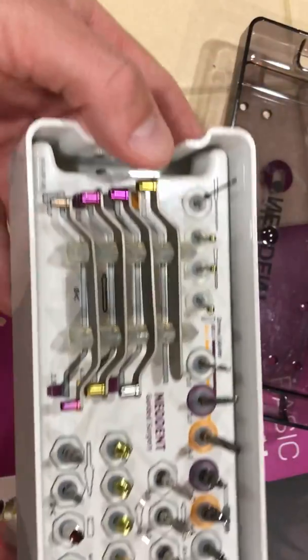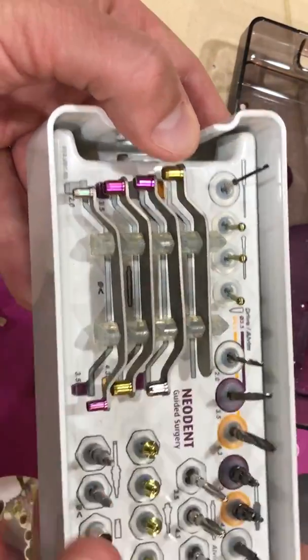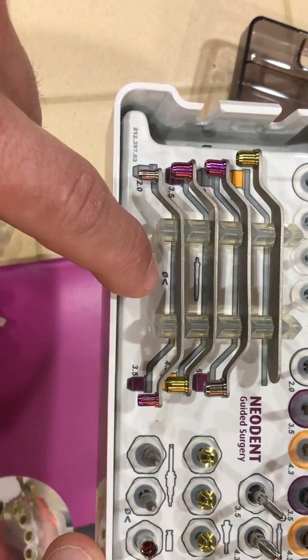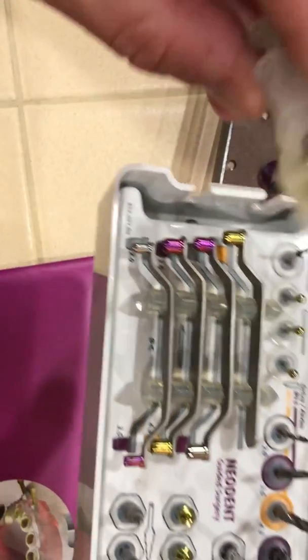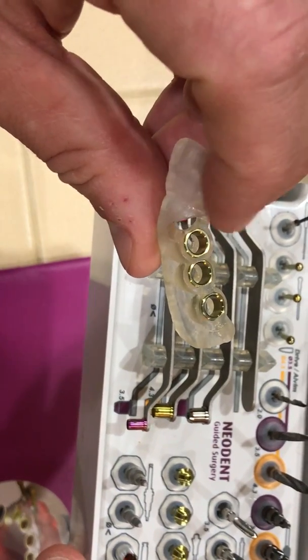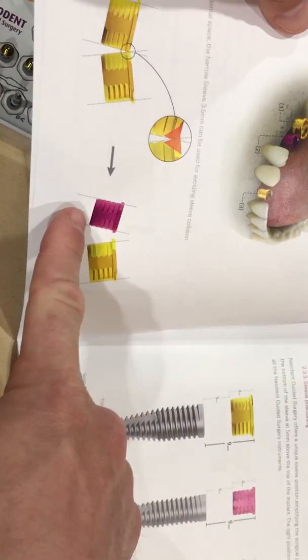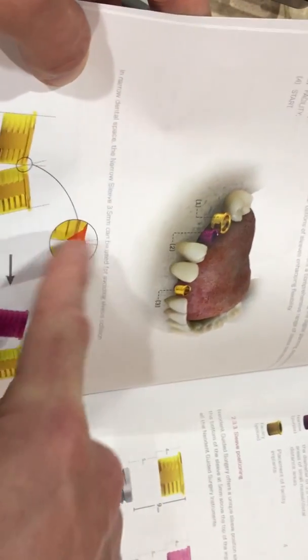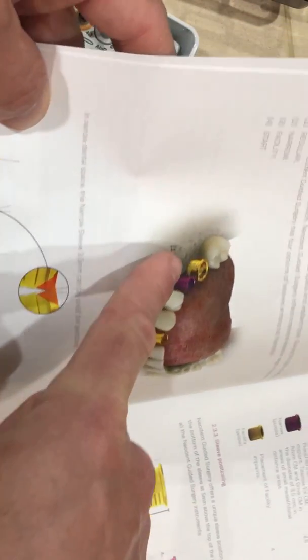We have our spoons to help walk us through. The spoon at the bottom has a little less-than symbol — it's for the narrow sleeve. We actually have a magenta or purple-looking sleeve that's used in narrow or tight spaces. This is only for the 3-5 implant. Sometimes the picture helps greatly. If the sleeves are too close to one another and we can't fabricate the guide properly, it may help to use a narrow sleeve.